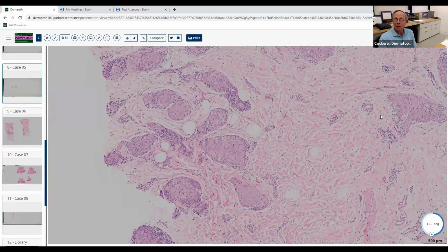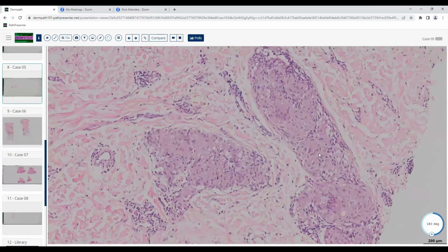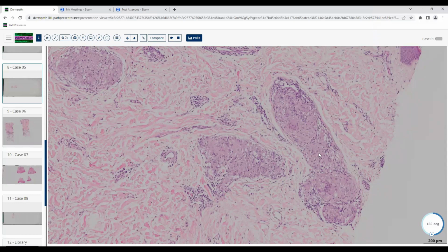Which type of leprosy? So there's two types. There's the lepromatous and the tuberculoid. Good. And then there's all the stuff between those. So the cool thing about leprosy, it's almost like a spectrum, like a tachometer. Basically you go from one pole that looks like sarcoid, the other pole looks like a diffuse xanthoma with gazillions of organisms in it.